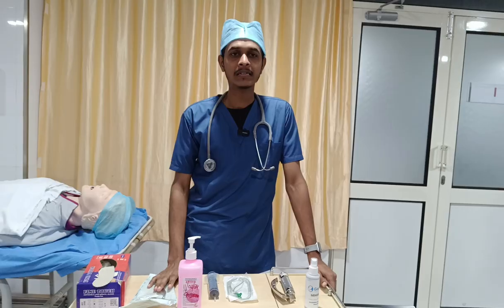If the person has a facial fracture or mandibular fracture, there is also a relative contraindication, but that is not absolute. Then we get into the esophagus. If the person has esophageal rupture or esophageal varices, we should not do it either. With esophageal varices, there is a chance of bleeding during insertion. So with esophageal rupture or esophageal varices, we should not do the Ryles tube insertion.